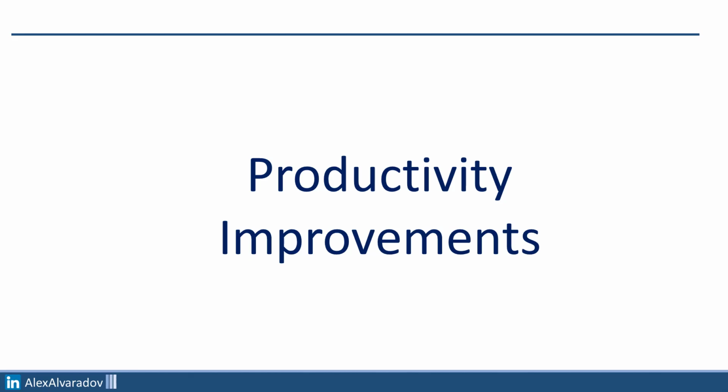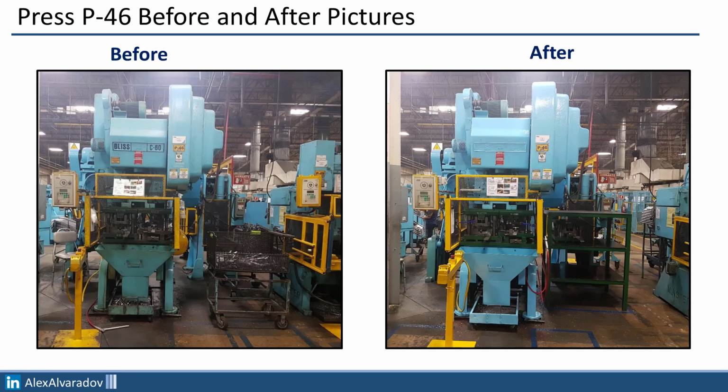Let's see some productivity improvements. On the left side, we can see how the press used to look like. And on the right side is how the press looks like right now after the improvements. We will get into the details of this.